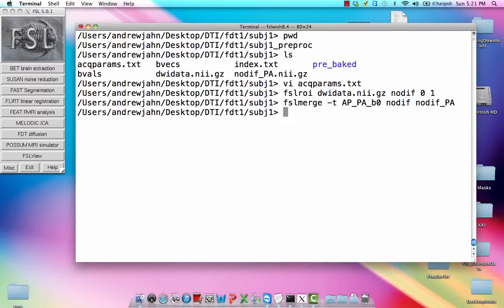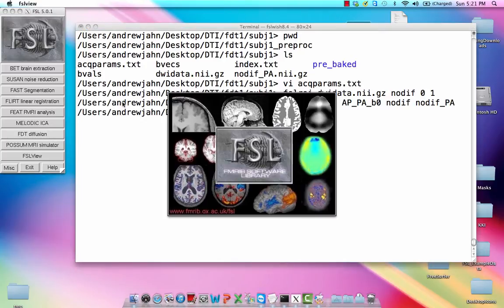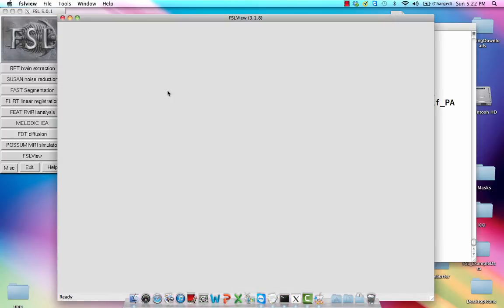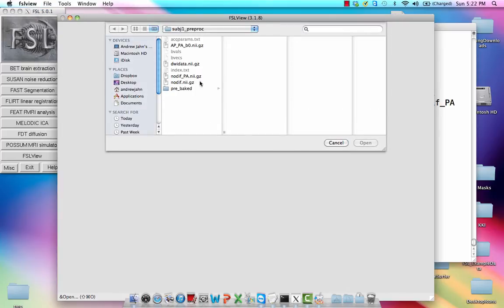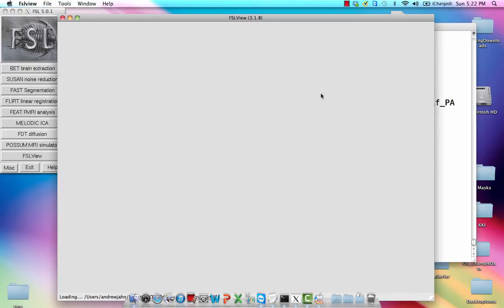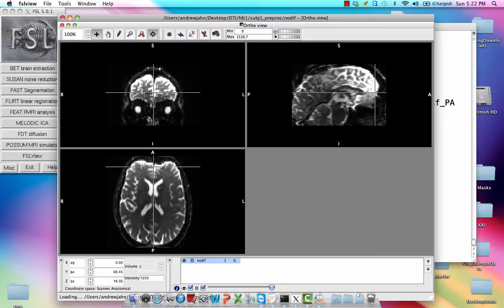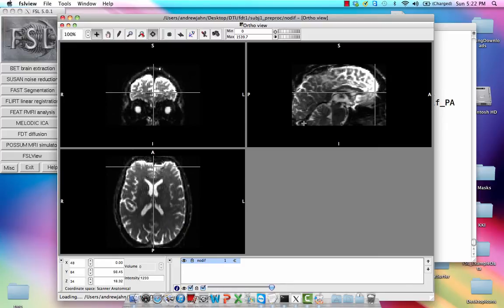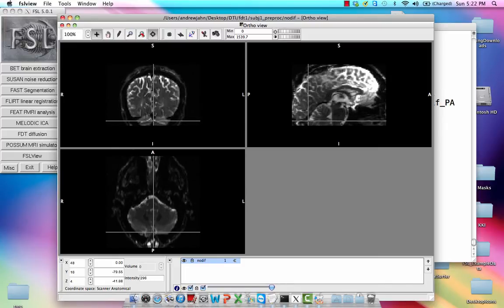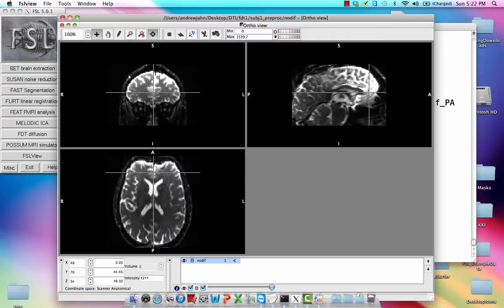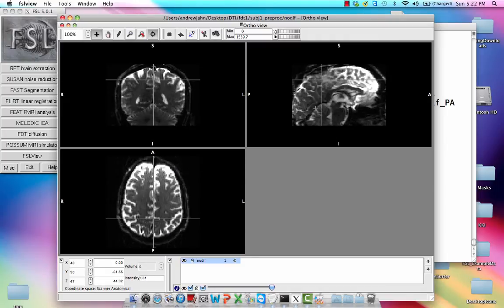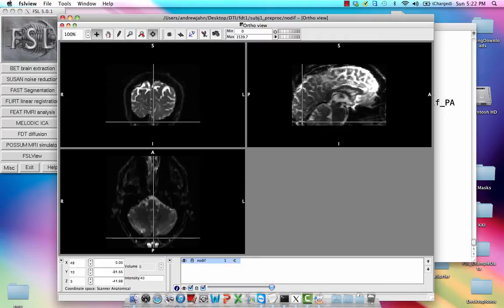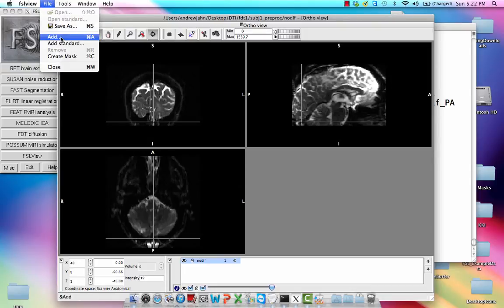So before we go on, let's just take a brief look at what those two images look like. So if we load up just the no-dif data set, if you just look around this, if you have a pretty good idea about what functional images should look like, some of this stuff may appear a little squashed or elongated in certain places, especially in the very posterior and the very anterior parts of the brain.